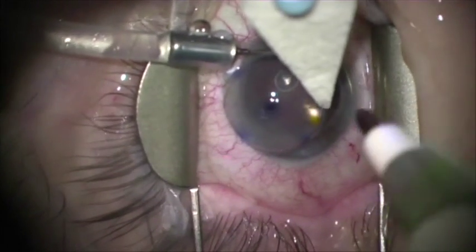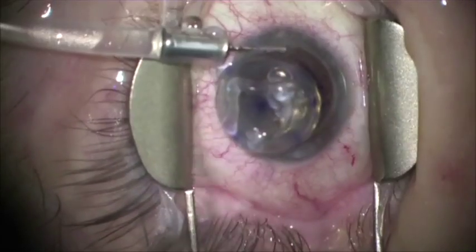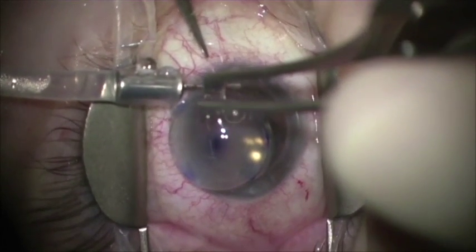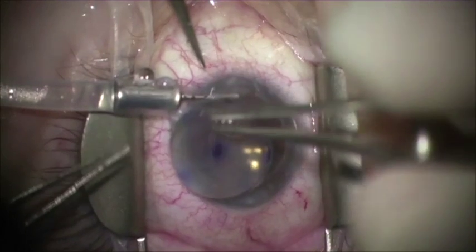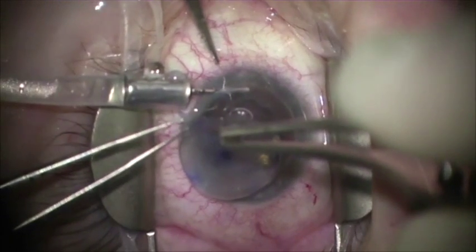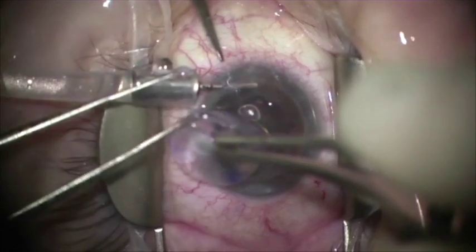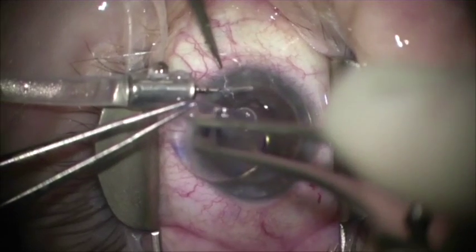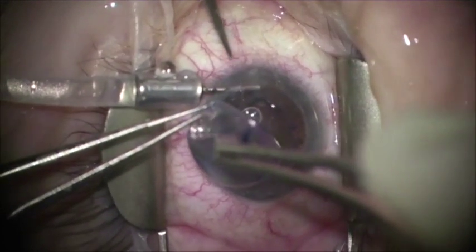I like to mark the edge of the DSAEK graft, put some viscoelastic on it, and then using the Pollock forceps and .12s, I strip the anterior portion of the graft off of it, and then with a tying forceps we'll pull the suture nasally and insert the graft, guiding it with the Pollock forceps.